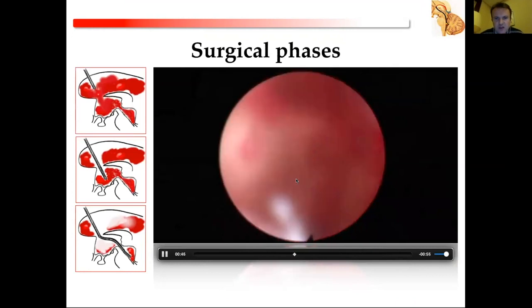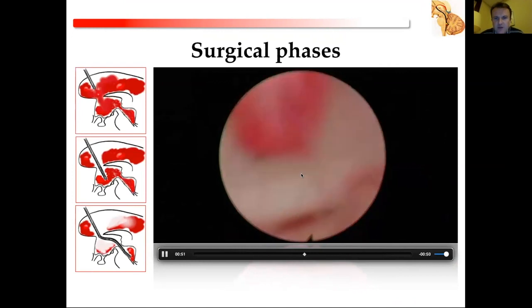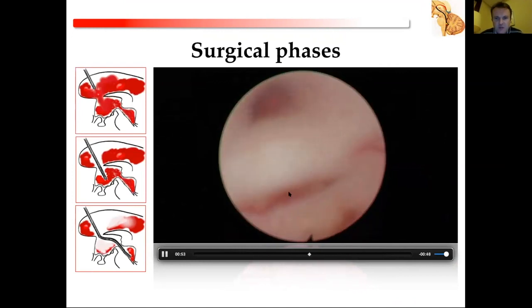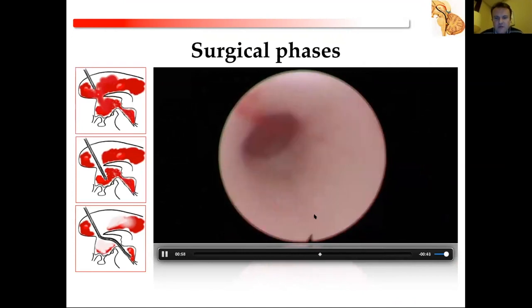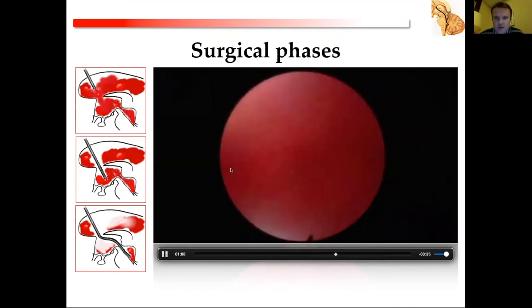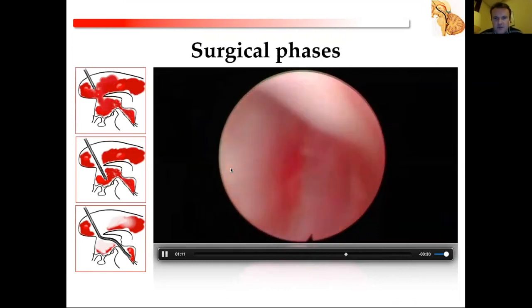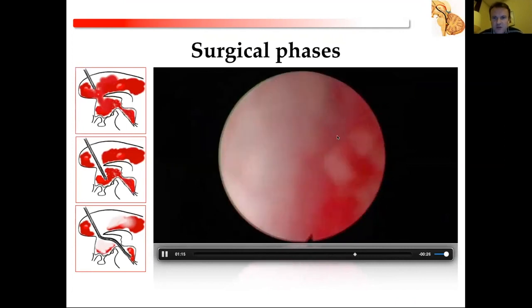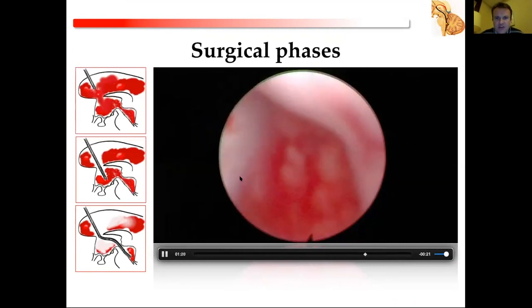Then you direct the endoscope to the posterior part of the third ventricle, and then you keep doing aspirations and irrigations, and finally you will see here the aqueduct, the aditus of the cerebral aqueduct, posterior commissure, habenular commissure. You can even see the roof of the third ventricle, and then of course you have to enter the cerebral aqueduct and aspirate the blood from the fourth ventricle. And finally, after the complete aspiration of the blood, you will be able to see the Luschka foramen with its choroid plexus, and also the Magendie foramen.